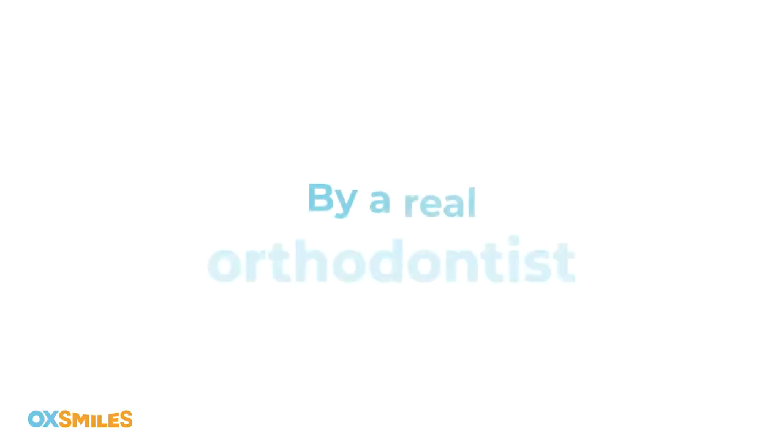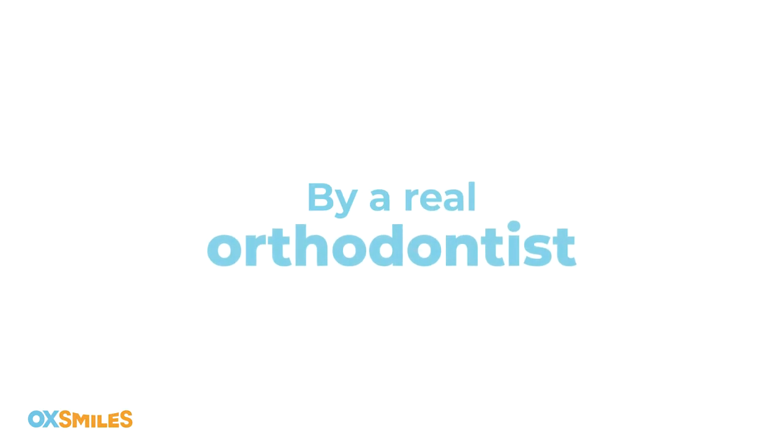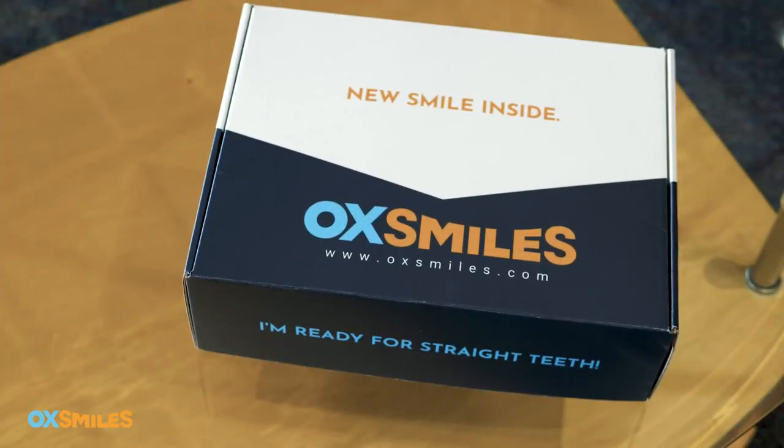Get a smile you can show off with OX Smiles. You get a customized treatment plan by a real orthodontist at an affordable price and without the fuss of in-person appointments. Getting your new smile starts with this box — check out the training materials and of course watch this video before starting your impression. Let's get started.